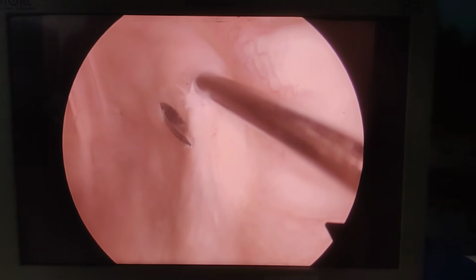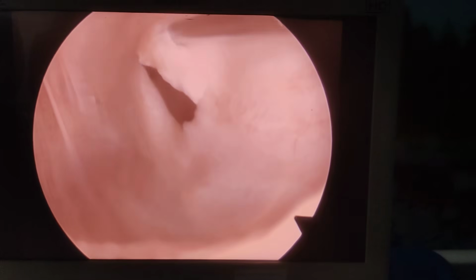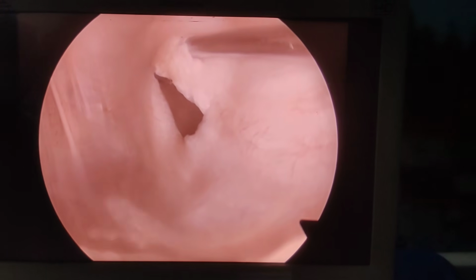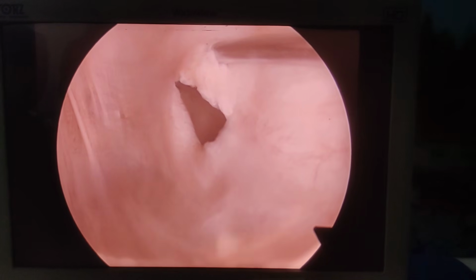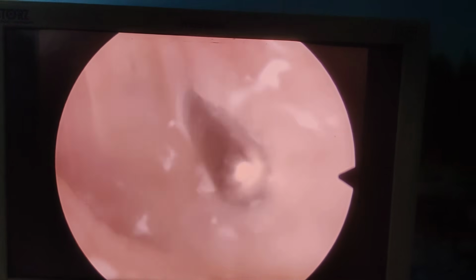Now I'll take a knife, and then I will, in the same line, come inside into the posterior aspect of the knee. So my camera is still in the anterolateral portal. I'm just using a knife just to create a place, and then we will pass a sheath. So this is just to give you an idea. Once I have made my hole, I will pass a sheath, and I will show you how it looks.